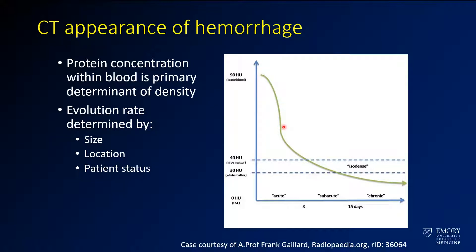Over time, it's going to go down and become somewhat isodense to gray and white matter. This is when you're in a window where you can have isodense subdural hematomas. Over time, it becomes more chronic and will get closer to the appearance of CSF.